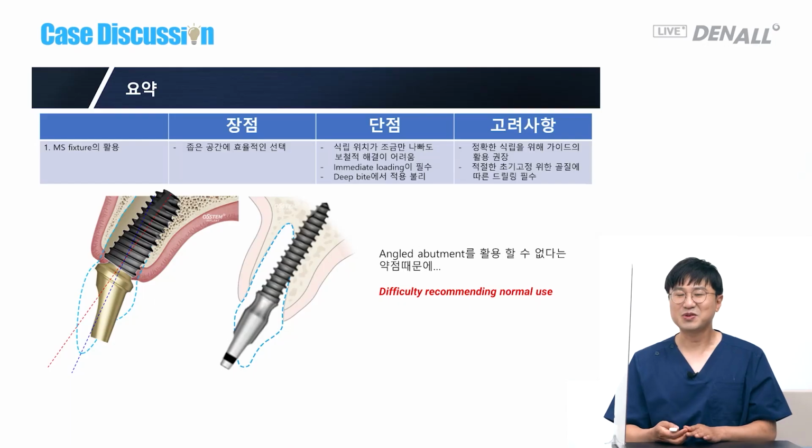And the patient of the case under discussion, a similar patient came to me recently and I would do a bridge with cantilever. Canine would be reduced and a bridge with cantilever is something I can do skillfully. I'm not as confident as Dr. Kim in placing 3.0 millimeter implant in such a narrow space. I will become a culprit as soon as I invade on the adjacent tooth.